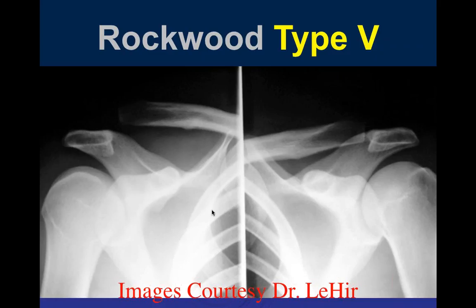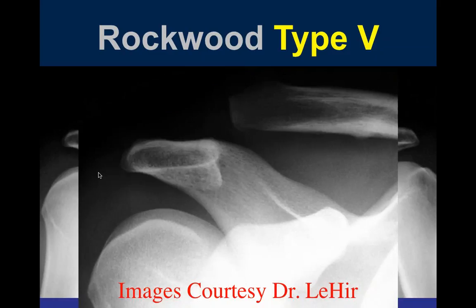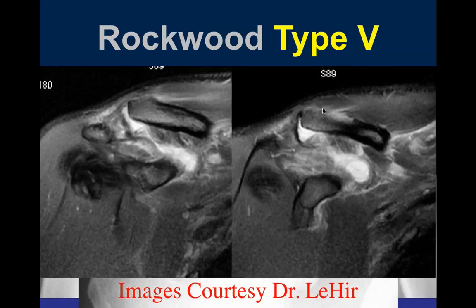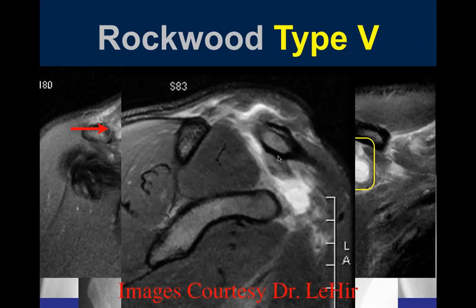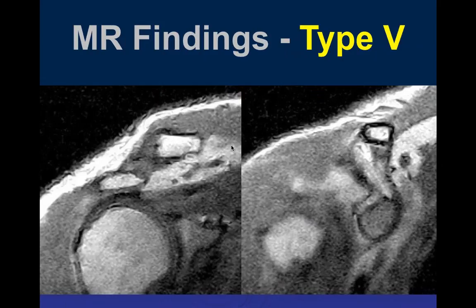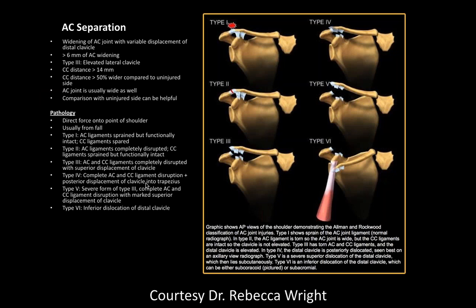This case from France shows the asymptomatic side on the right and the symptomatic side on the left — inferiorly displaced with the superior margin of the acromion below the inferior margin of the clavicle. MR examination shows the CC ligament tear, surrounding edema, and the deep fascial tear adjacent to the trapezius. This is a classic Type 5, also visible on a low-field scanner.